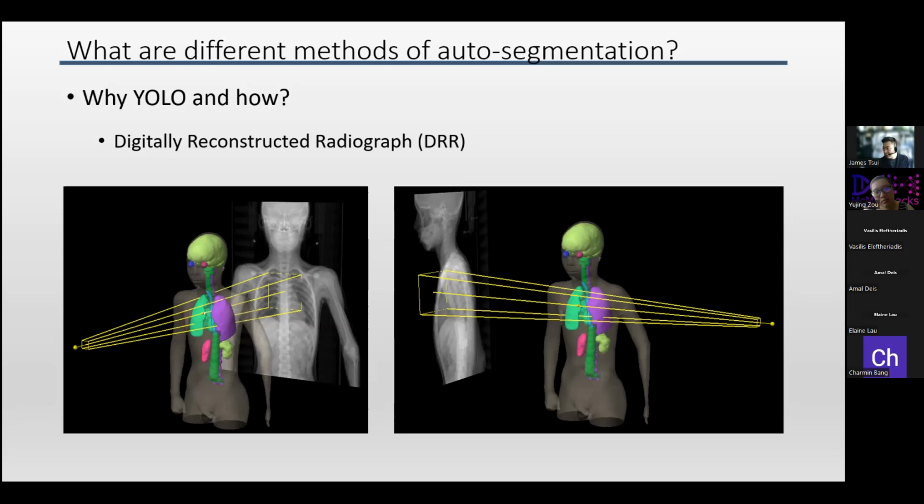Okay, so some people in the chat ask, can you elaborate more on how you relate nnU-Net and YOLO here? nnU-Net is for semantic segmentation, YOLO is for detection. So I'm explaining now. YOLO is for detection, yes, it gives you a bounding box. With the bounding box, I could find exactly where it corresponds to in the whole 3D CT volume and feed that into an organ-specific U-Net segmentation. Does that answer your question, Hazrat? Basically, I'm splitting it into a two-step process.